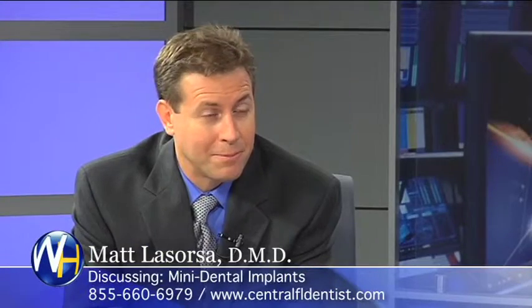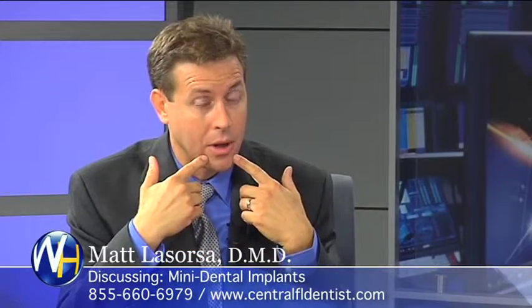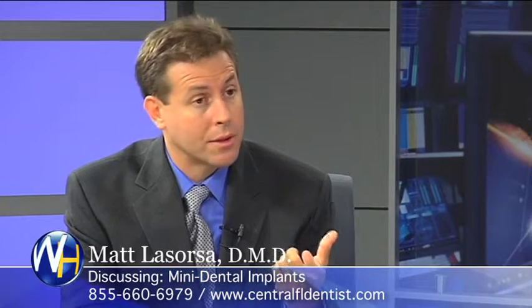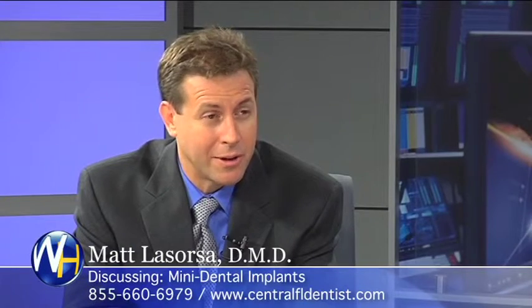So when I hear same day teeth, somebody walks in, right? I'm assuming you have imaging ahead of time, but they could go in without teeth and walk out with a full arch of teeth that are fixed in their mouth. That's right. Not an exaggeration. We do it all the time. We have a surgical stent that tells me where to place the implants. In the lower, we place 4 mini implants. In the upper, we place 6 mini implants. Then we have the housings to snap on. They can put a full arch of teeth in and walk out in the same day and go eat whatever they want. Are they surprised to hear this on the consult? Yeah, sometimes they're in a little bit of disbelief that it can be done.